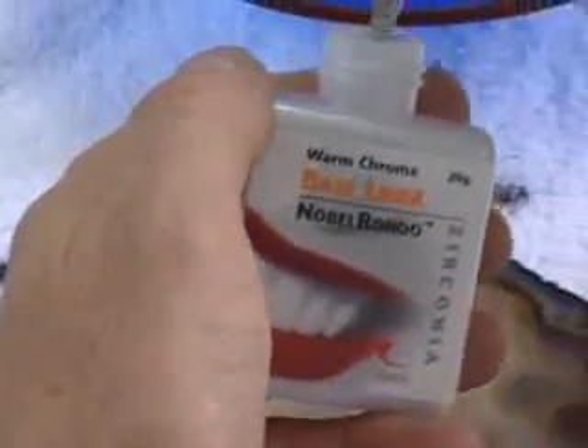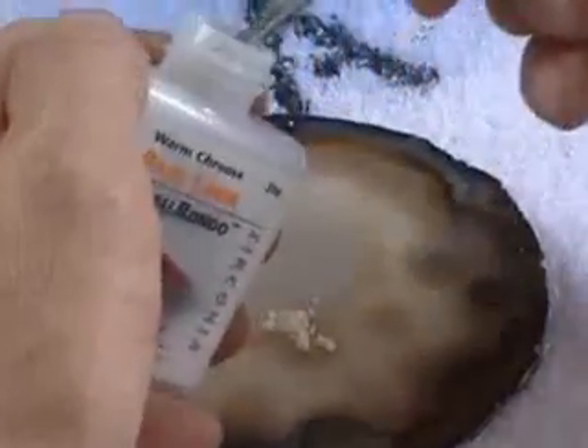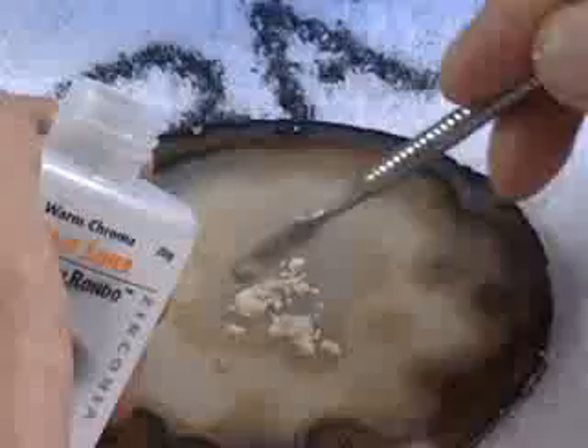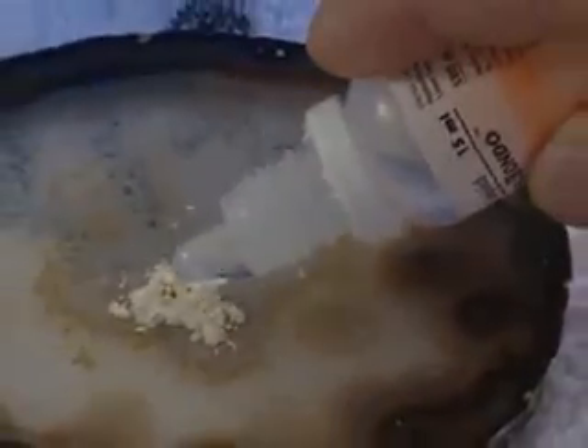Back in the laboratory, the veneering can begin. For individual colouring of the translucent white zirconia substructure, the Nobel Rondo zirconia base liner can be used together with the intensive liner modifiers to provide characterisation.